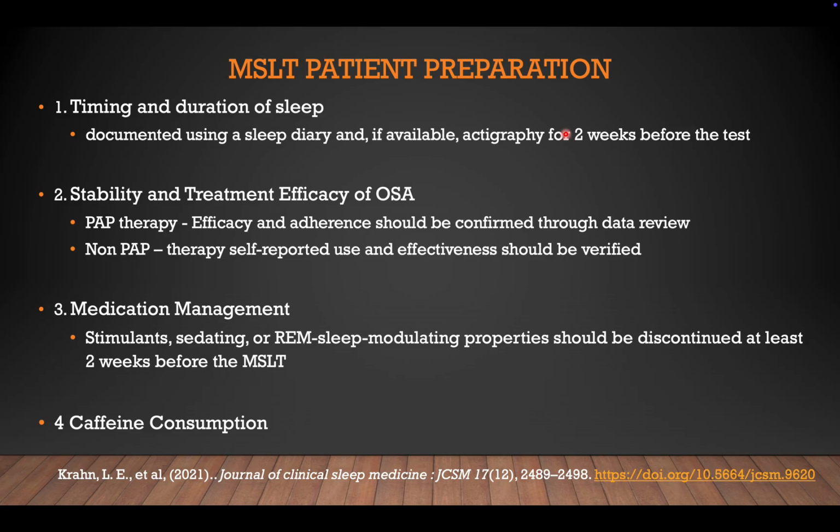So the preparation starts at least 2 weeks before the test, as in the case of documentation of the sleep diary, or for that matter, using an actigraphy, which gives the actual sleep-wake schedule. Then there should be stability and treatment efficacy of OSA.